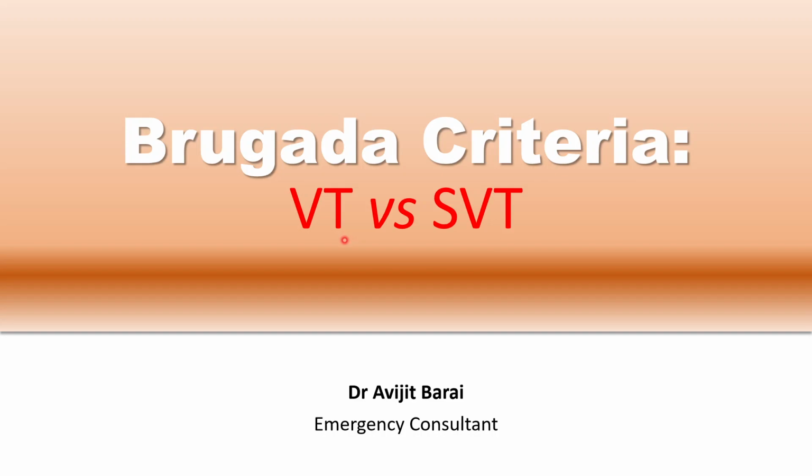I ask this question all the time: how to differentiate between VT and SVT. There are different ways to differentiate between VT and SVT. One of them is Brugada criteria. In this particular video, we are going to talk about Brugada criteria and how we can use this in our clinical practice to differentiate between VT and SVT. So let's dig into it.